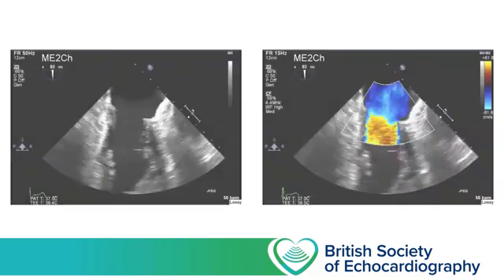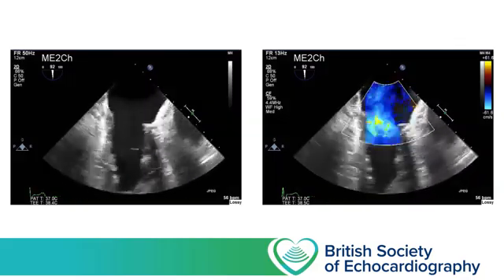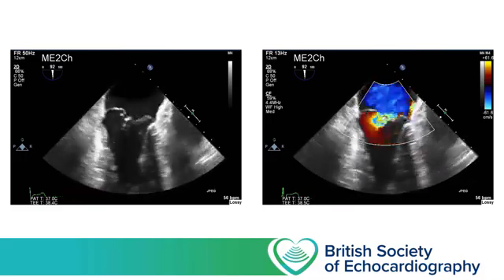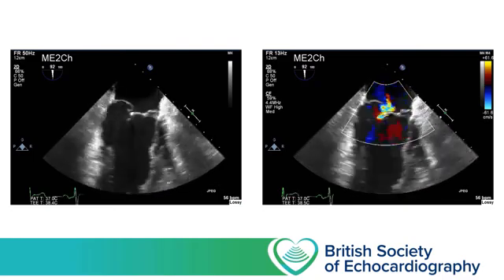If that last case was an example of restricted mitral valve movement, what about a case of excessive movement? So this is an intraoperative TOE of a patient undergoing mitral valve repair for prolapse of the P3 scallop of the posterior mitral valve leaflet.